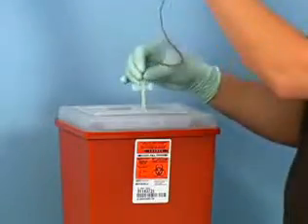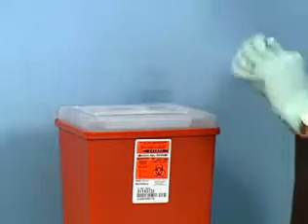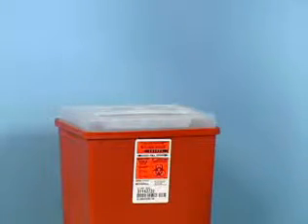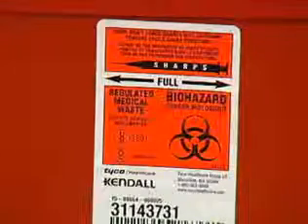Immediately discard the entire setup by first dropping the needle into a biohazard sharps container followed by the tubing and holder. The OSHA standard requires immediate disposal of the entire setup to prevent a needle stick injury. OSHA does not permit the removal of the needle from the holder. Removing the holder exposes the sheath-covered posterior needle, which could result in a needle stick injury. In addition, the holder is often contaminated with blood and must not be reused.